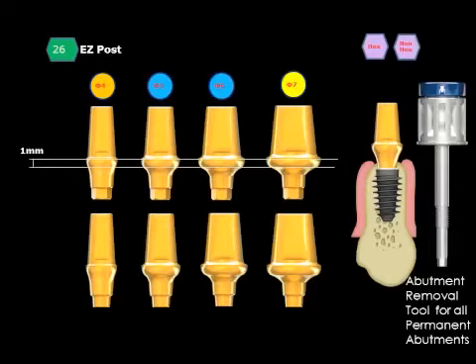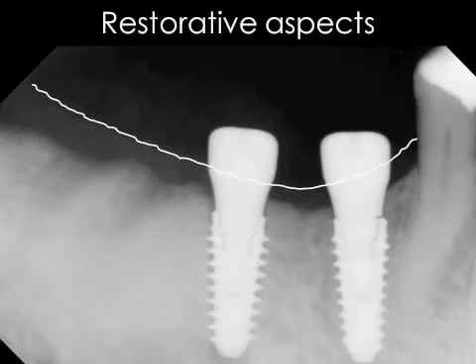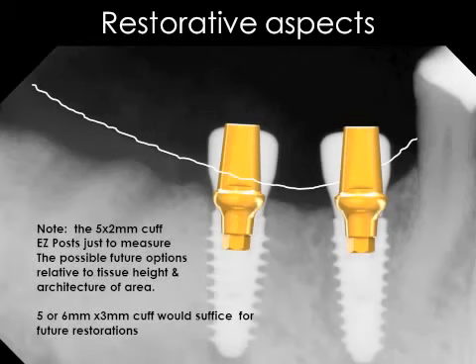Anything that's final as far as the abutment goes utilizes that abutment retrieval tool that you saw in there, and you will use that to remove any final abutment as that 5-degree Morse taper truly grabs that abutment into place.